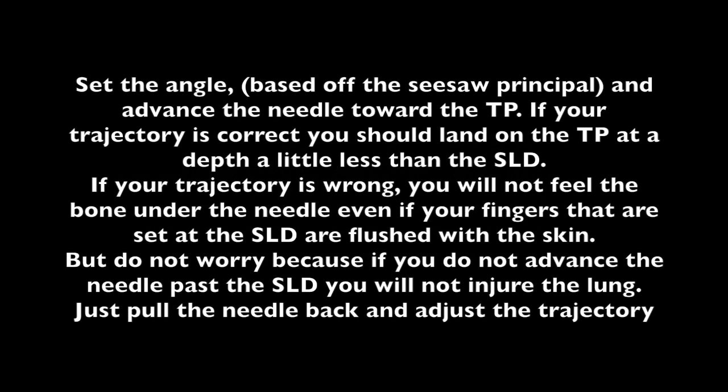Set the angle based on the seesaw principle and advance the needle toward the teepee. If your trajectory is correct, you should land on the teepee at a depth a little less than the SLD. If your trajectory is wrong, you will not feel the bone under the needle, even if your fingers set at the SLD are flush with the skin. Do not worry — if you do not advance the needle past the SLD, you will not injure the lung. Just pull the needle back and adjust the trajectory.